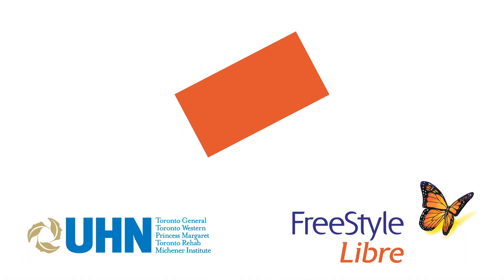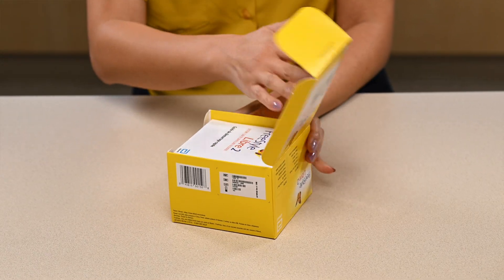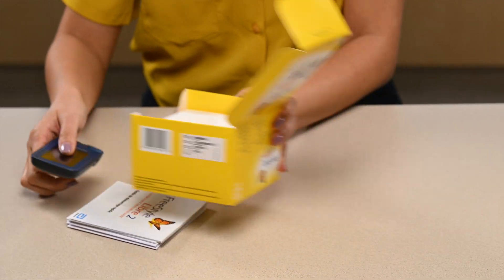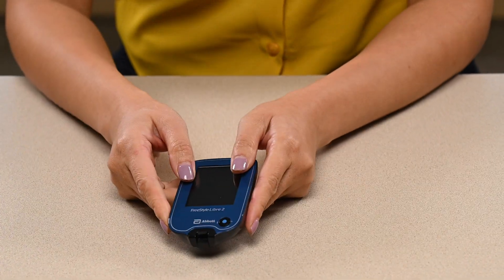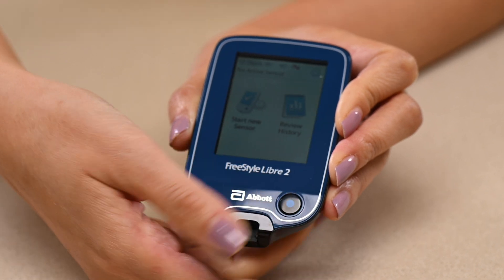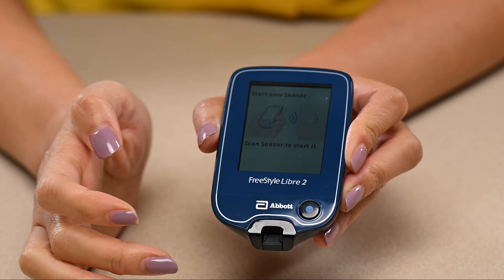Step 4: Start the sensor. The rest of this video shows how to start the sensor by using the reader. If you would like to use the mobile app instead, follow the instructions in the Using the Libre app for the Libre2 system video. To start the sensor using the reader, press the blue button to turn on the reader. Tap the Start New Sensor button on the screen.